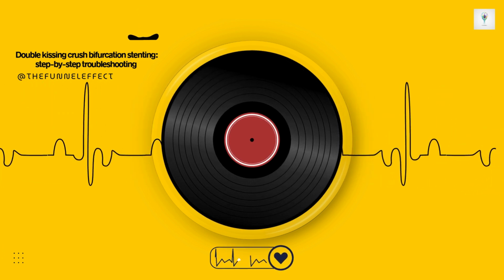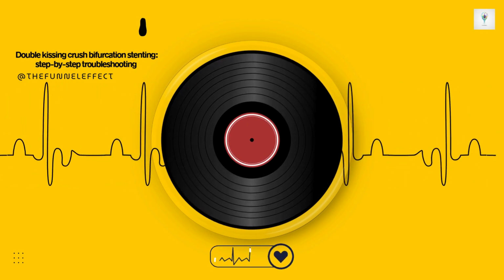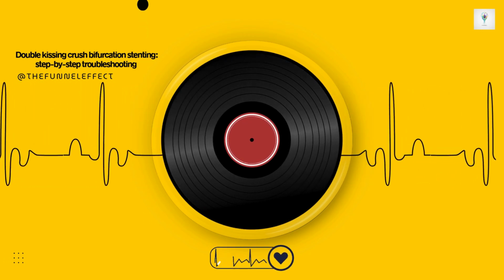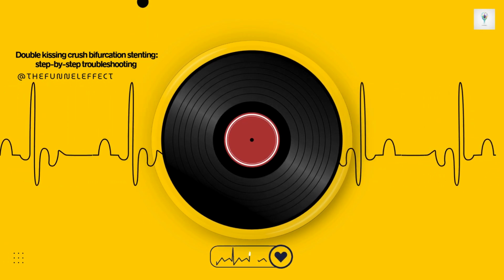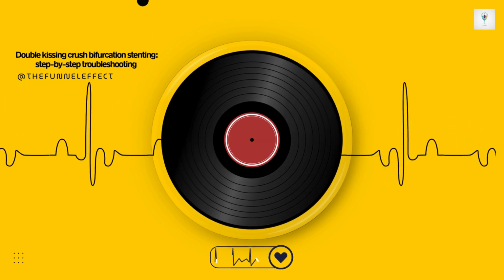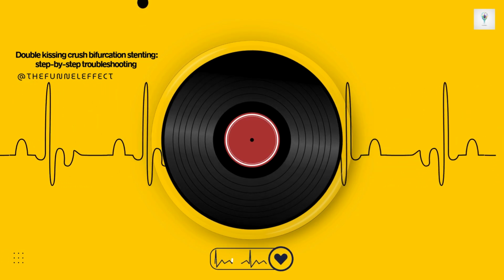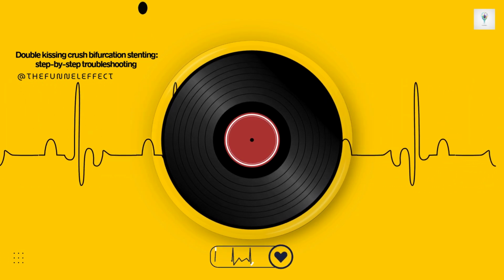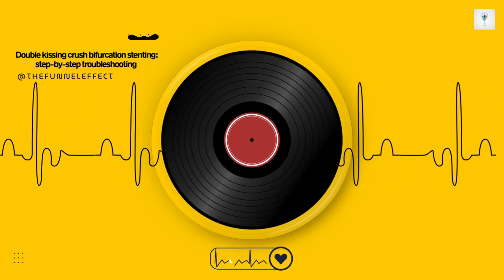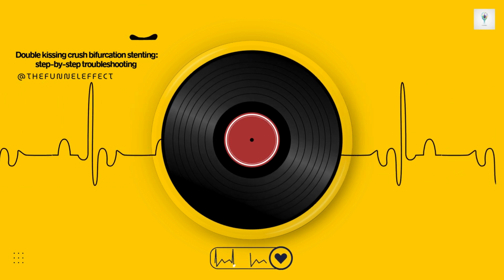Okay, let's assume you've successfully rewired the SB proximally. Step 6. The first kissing balloon inflation, KBI. 2 balloons, one in MV, one in SB, inflated together. Sizing must be key here. Sizing is absolutely critical, and again, imaging like IVUS or OCT is your best friend for getting it right. For the balloons themselves, you size them according to the reference diameters of the distal MV and the SB. But for understanding the proximal main vessel segment, where both balloons will be inflated side by side, we often refer to Finet's law. It's a geometric principle.